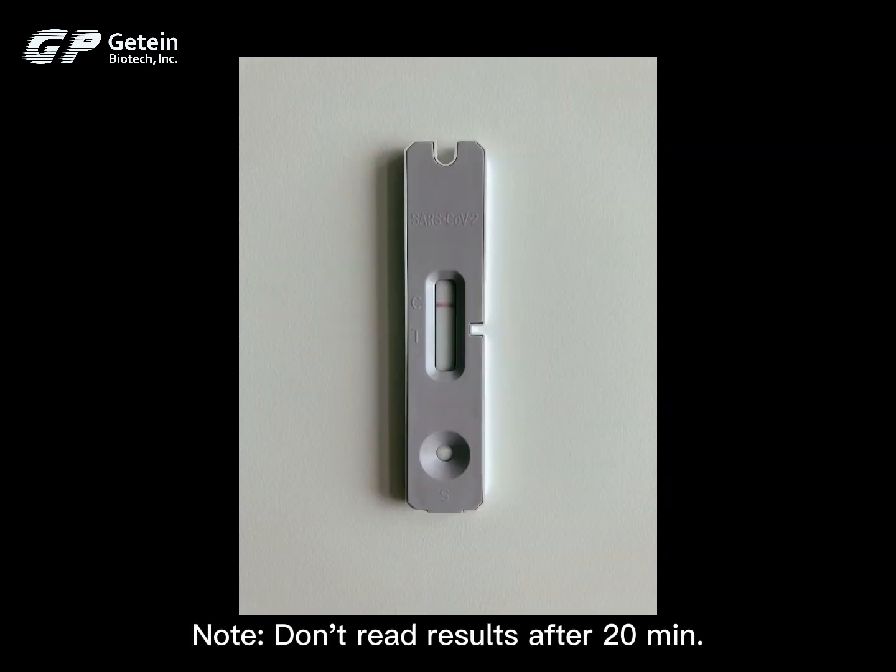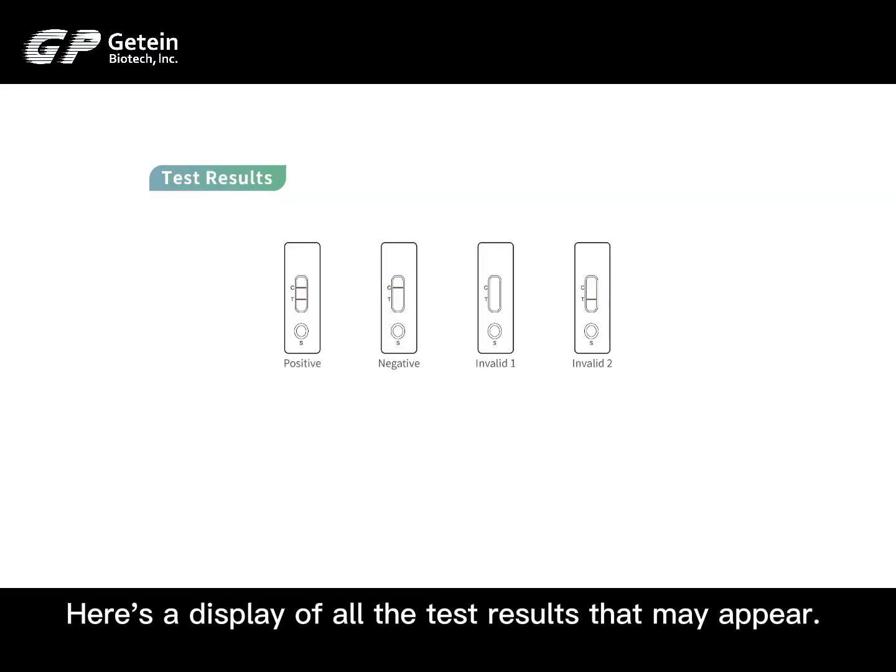Note: do not read results after 20 minutes. Here's a display of all the test results that may appear.